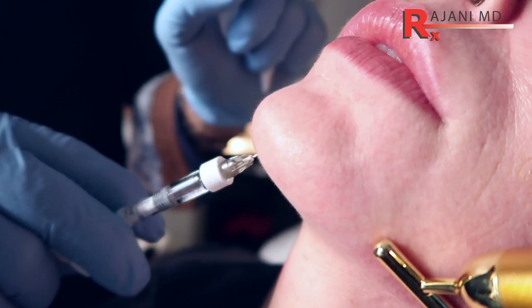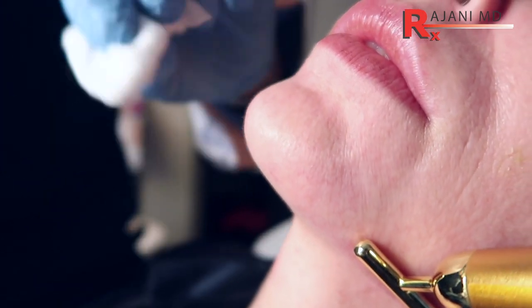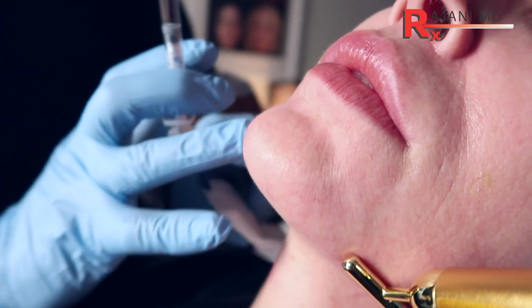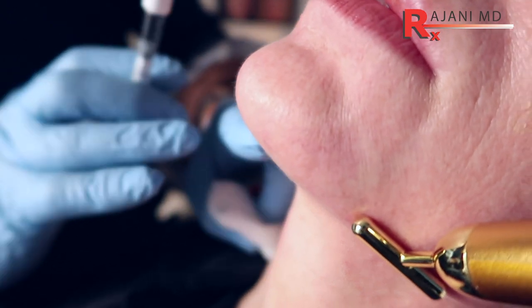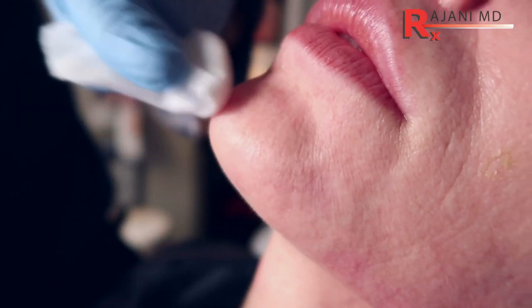And it's nothing to do two or three, even four syringes, because remember, a chin implant would be several syringes. They come around to the edge and often you cut them out to form what you want. In this case, we just need forward projection.